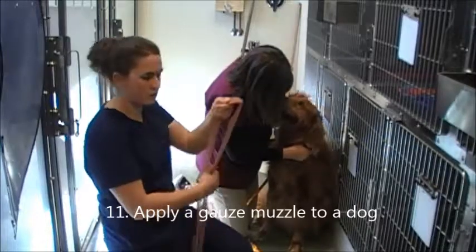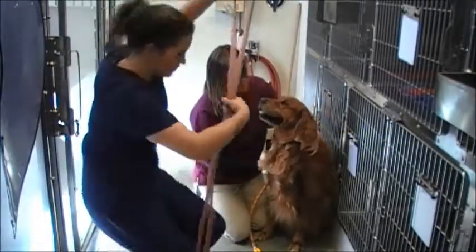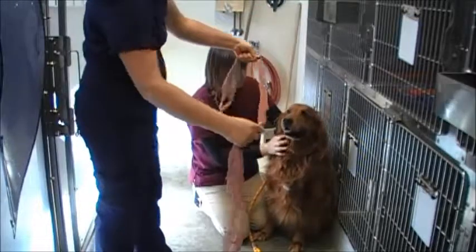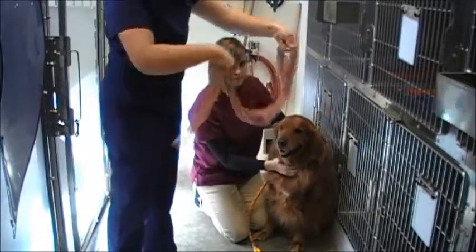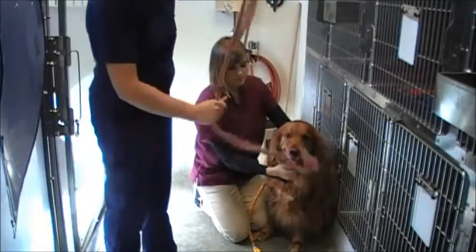I'm putting a gauze muzzle on a dog. I've already ensured that I've got the length I need to get all the way around his head. I'm going to double my length and tie an overhand knot in the middle, and pull this one tight all the way.